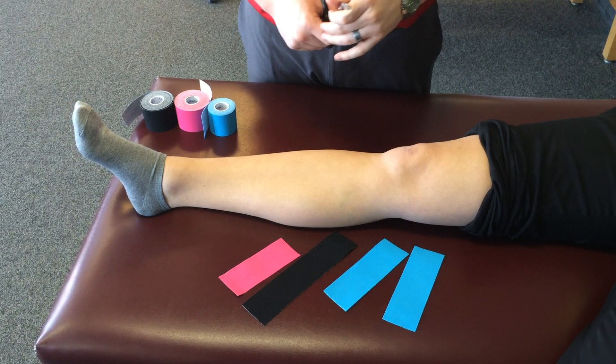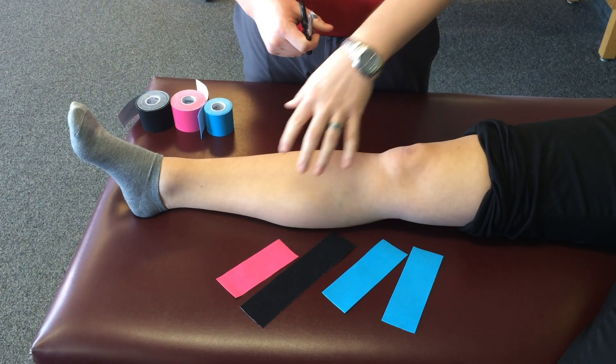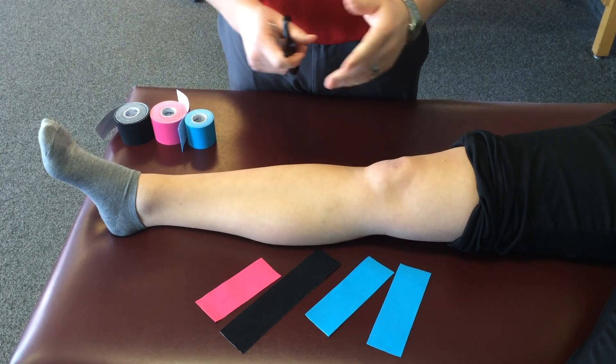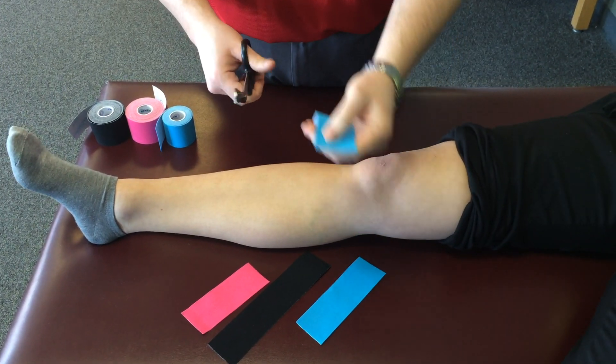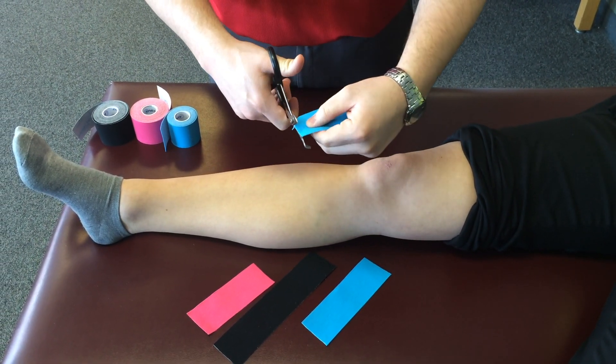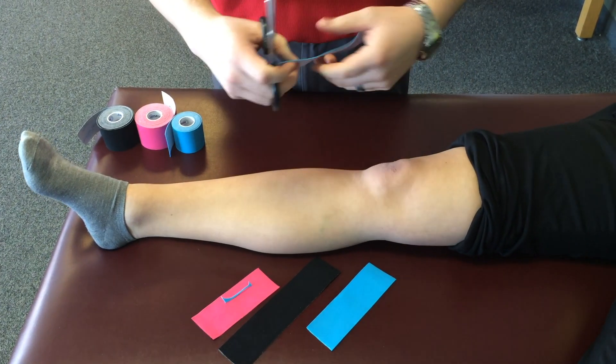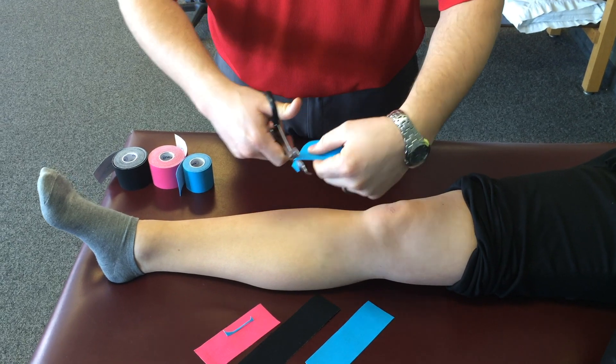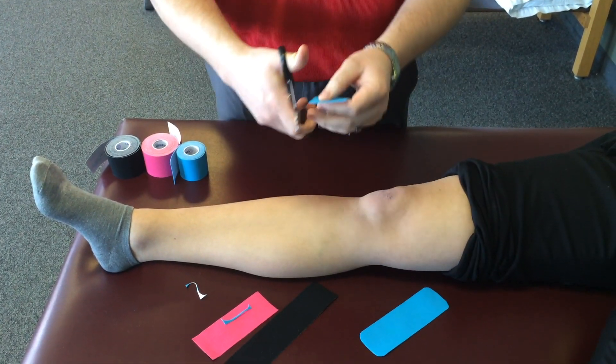I've cut the different strips to different lengths. The different colors will be applied across the knee in certain areas. Now some people leave their corners squared — I like to round all mine off. It helps keep the strip from peeling off when the patient puts their shorts or pants back on, or gets involved with some activity where there might be some friction across the edges of the strips.